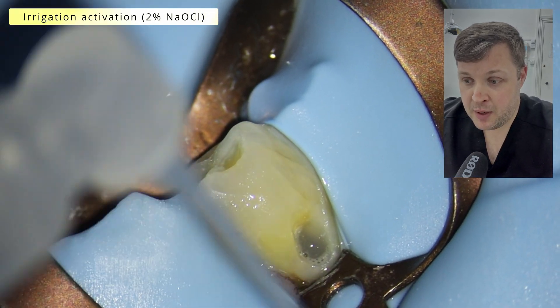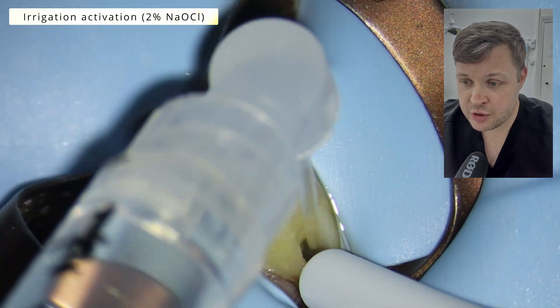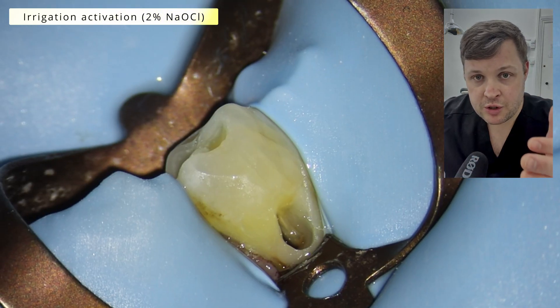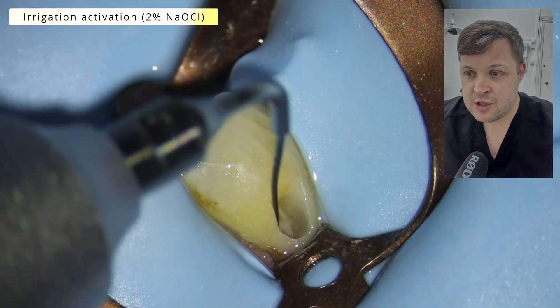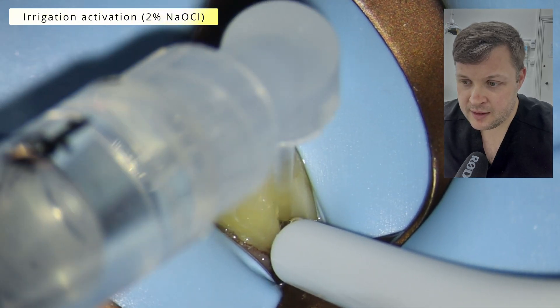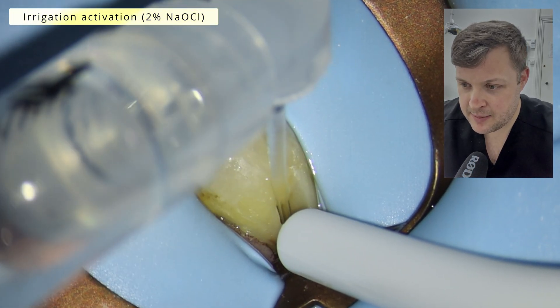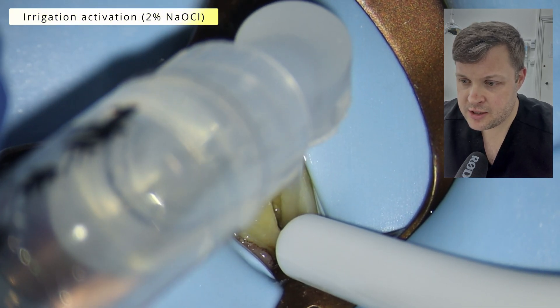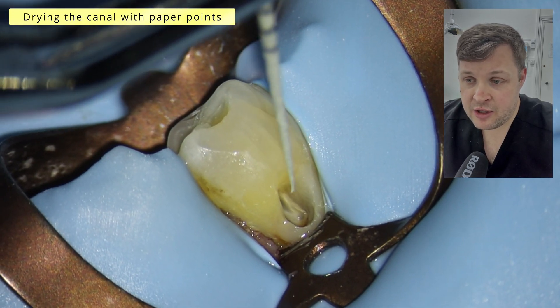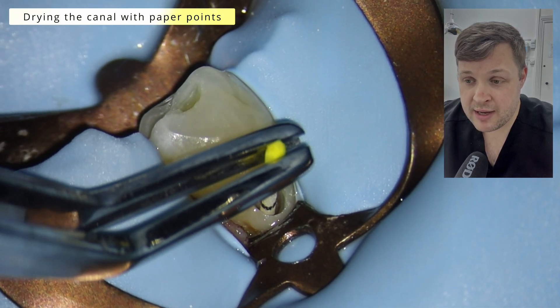The final part of the irrigation is activating the irrigants with ultrasonic activators. You'll notice all the debris stuck to the canal walls dislodging — the irrigant looks clear, but once you activate it, it gets all the nastiness out. It's absolutely fantastic. Lots and lots of irrigation. Then we aspirate, get the canal as dry as possible, and use matched paper points. You can pull the paper points out and see where they are moist to help confirm working length if you're not fully happy.